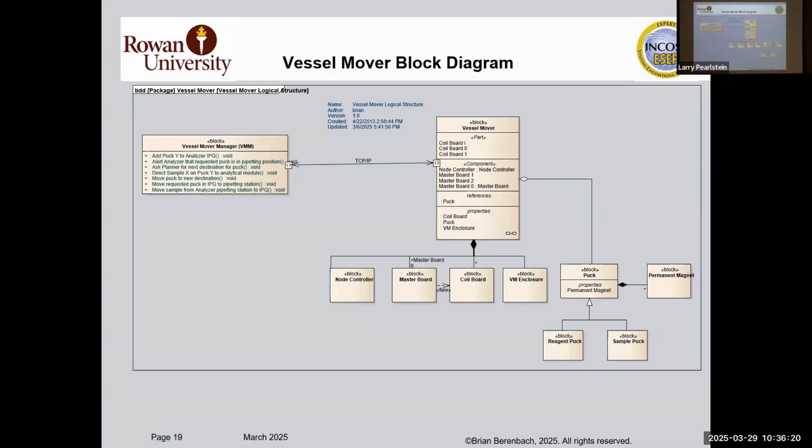So we have, that's the other thing. This is very clever. So the question was how to add the reagents. Like with the printer, you get a thing that pops up and says red low or cyan low, and you have to replace it.